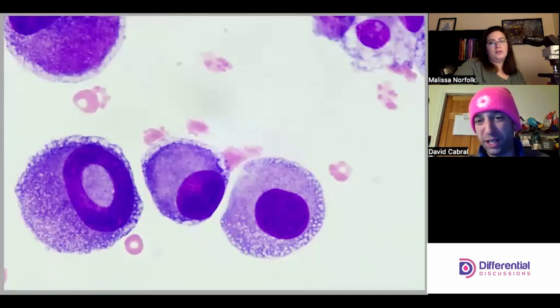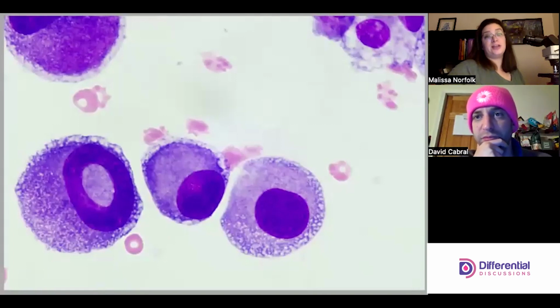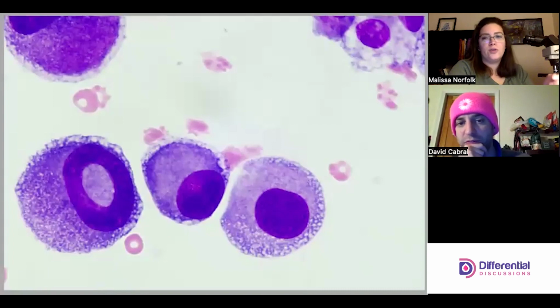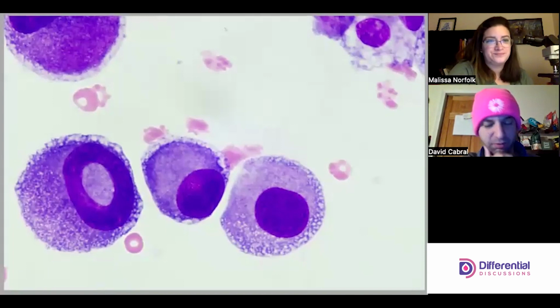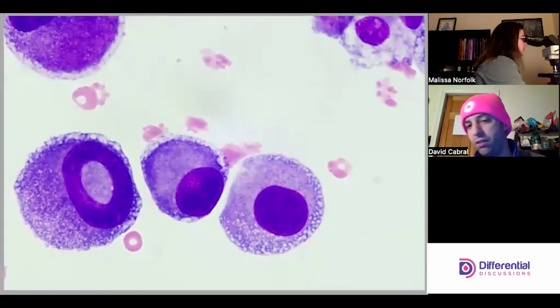What do you think? Do you like meso on the one on the right? I'm debating. I think I'll leave it for now, and then I want to look around a little bit more on 100 and see. Try to find a nice, healthy looking meso, and then we can decide whether this one is actually a meso or not. So I agree. If you're the one doing this diff and you want to start your diff here, but you're unsure what this patient's mesos look like, what this patient's macrophages look like, you can start your diff, but chances are you're going to restart it, clear, and restart again because you're going to actually figure out what this patient's mesos look like and then come back and be like, oh, okay. Agreed. So let's look around a little bit.